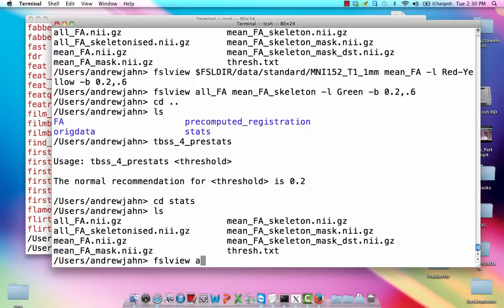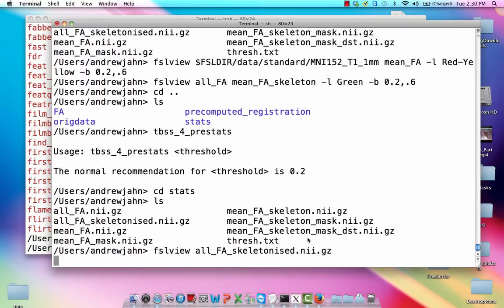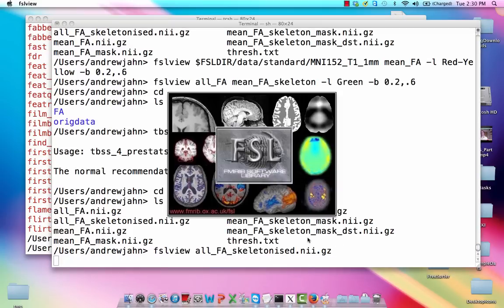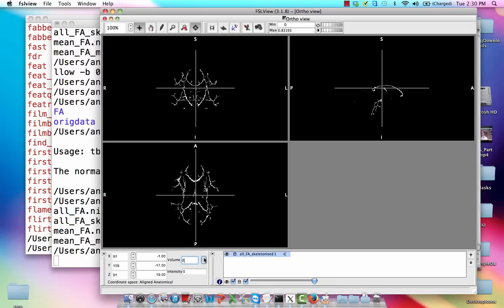Okay, so the output from this is going to be this all-FA skeletonized data set. And again, once we have that, we're going to look through each subject just to make sure that nothing looks too out of whack, that there's relatively good alignment, and that the values seem to be sensible, that there's nothing too extreme here.